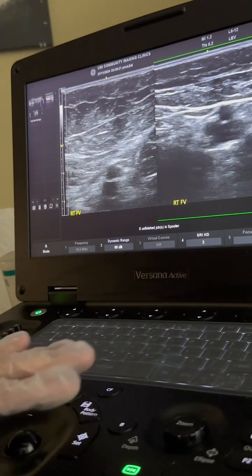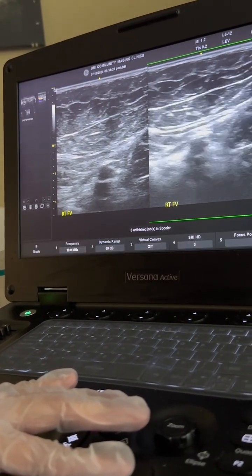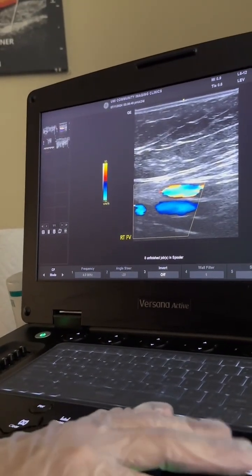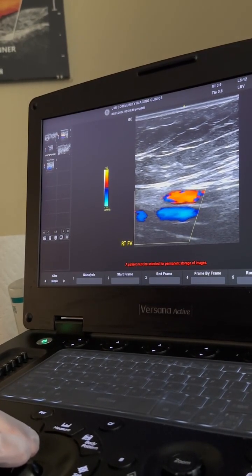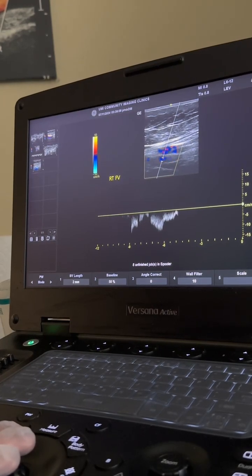We're then going to move to the FV, which stands for femoral vein. We're going to get a dual image of non-compression and compression of the FV. We're going to turn the FV into sagittal position and apply color so we know which direction the blood is moving. Same as the CFV, we're going to apply PW onto the FV.